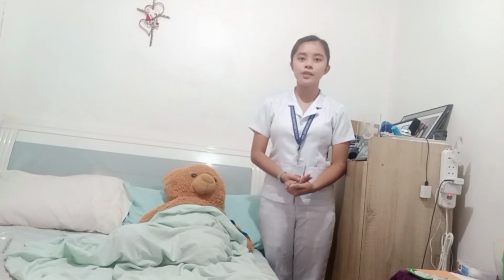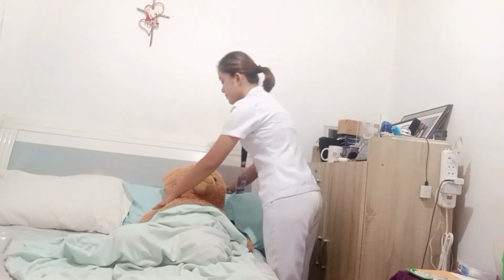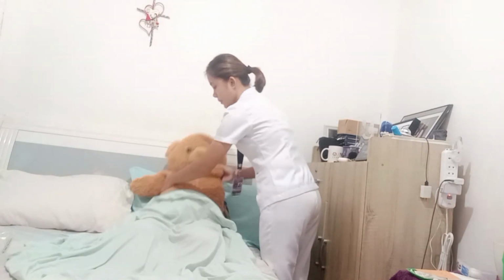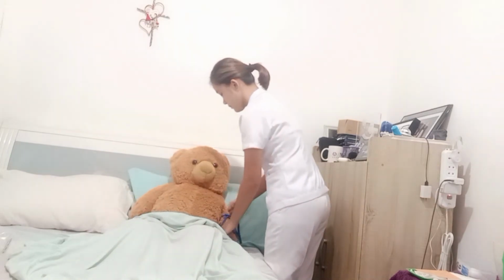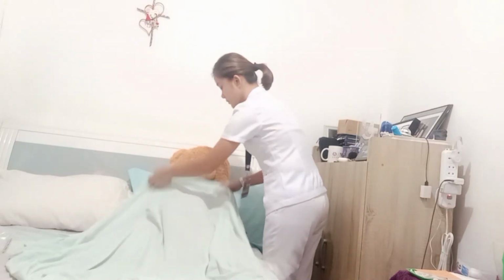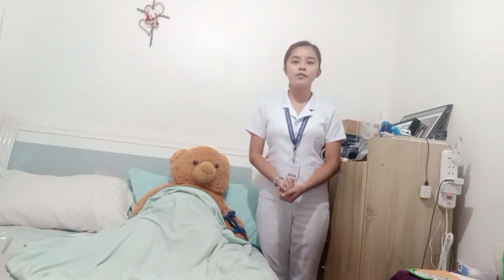Now help the patient find a comfortable position that will accommodate the injection site chosen and expose only the portion of the body needed. So ma'am, can you please sit down? Now I have to apply clean gloves and use anatomical landmarks to find the site again.